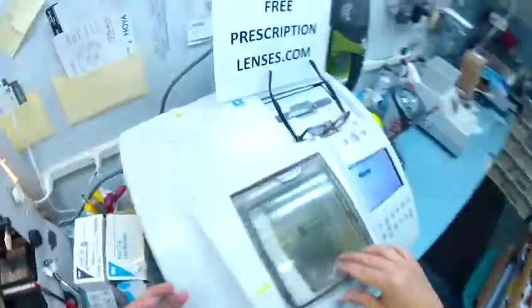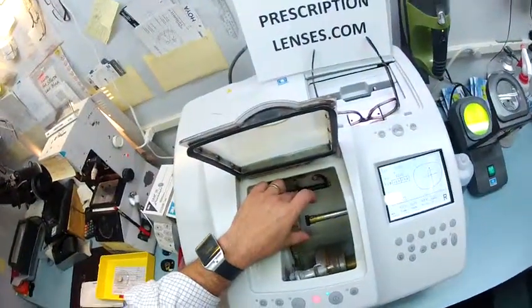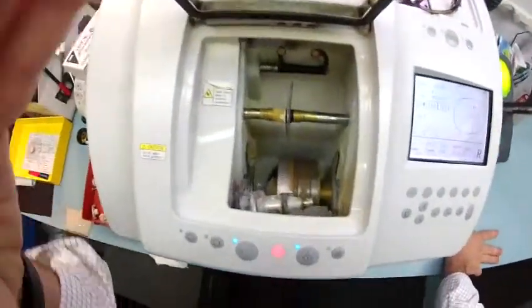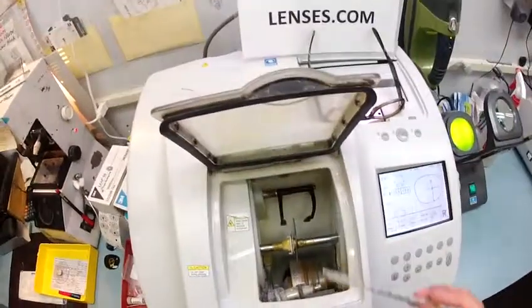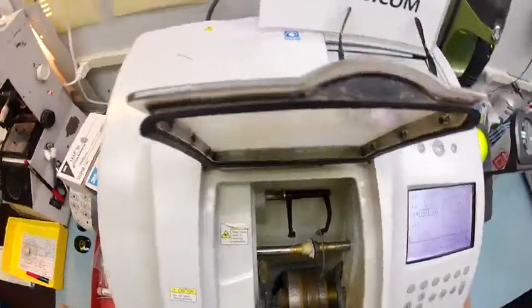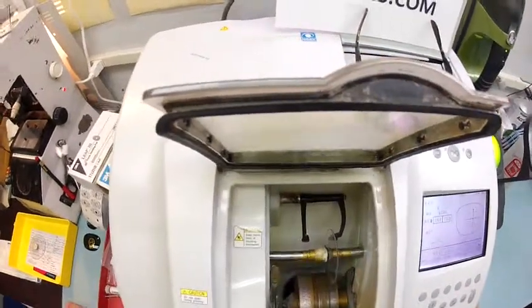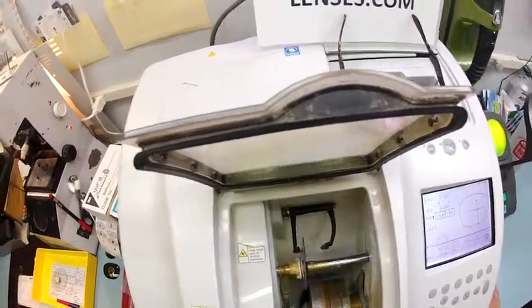So let me go ahead and take your right lens. And the first thing I'm going to do is put it into the chuck, or as I like to say, the Charles, because I don't know it well enough to call it chuck. But the first thing that's going to happen is these calipers are going to come down and trace the shape of your right lens to make sure that this is large enough to cut out. It is tracing the concave side of the lens first, which is closest to the eyelashes, and then it's going to move over and trace the convex side of the lens, which sits away from the face.